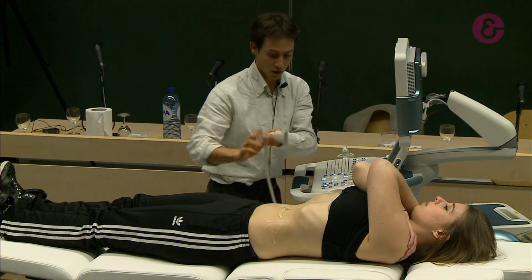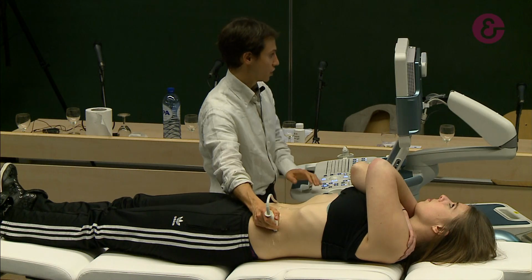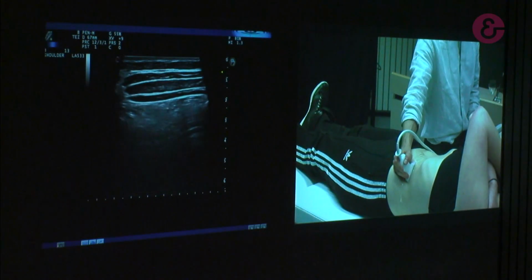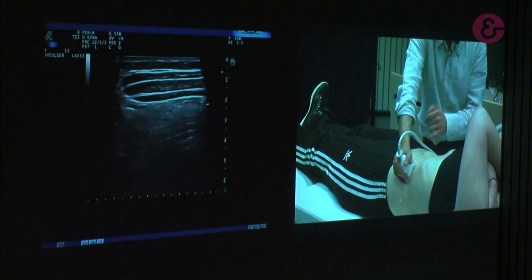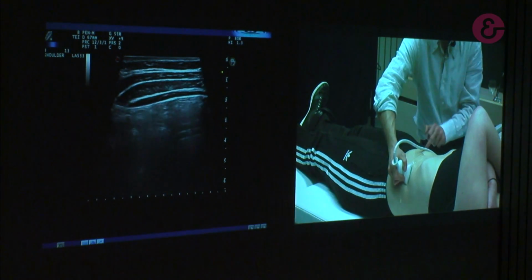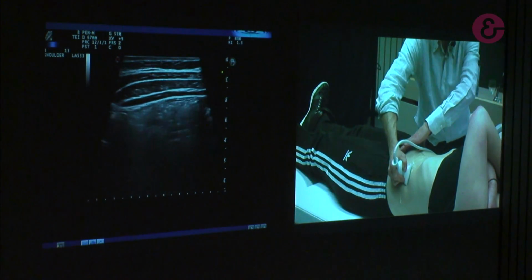Before starting the presentation, I spent around 10 minutes explaining to her how to activate this muscle. Now she is able to do that, but just to tell you, I asked her to imagine a cable that connects the two anterior SIS and imagine to tense this cable.